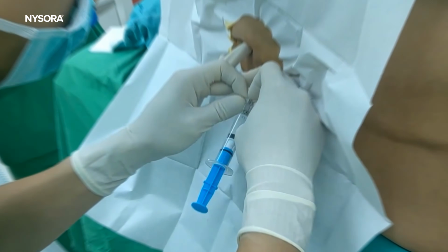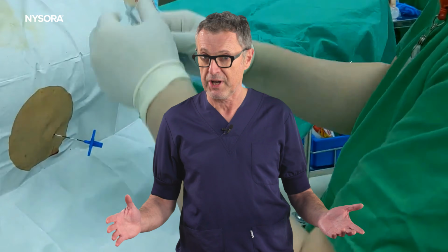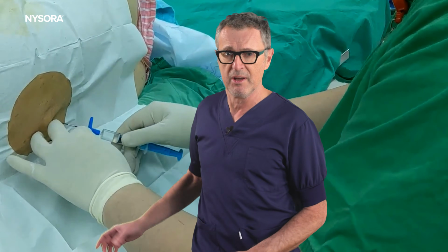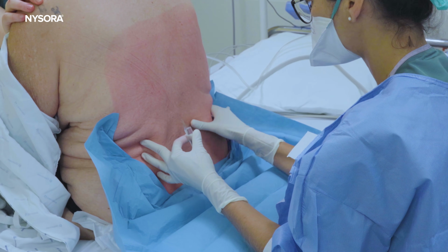Today we're talking about a very interesting topic. Should we objectively monitor the pressure changes during epidural anesthesia? Traditionally, this has been a skill that relied heavily on the anesthetist's touch and feel, a subjective measure that's been honed over years of practice, but difficult to teach.